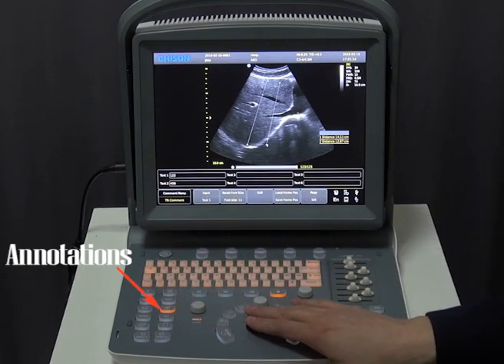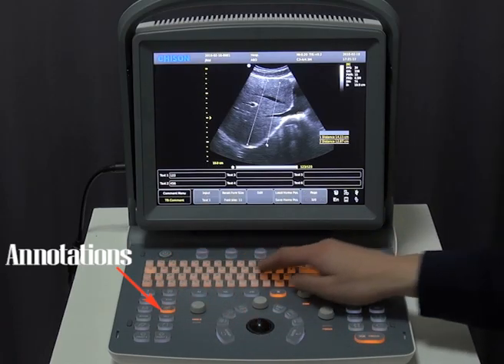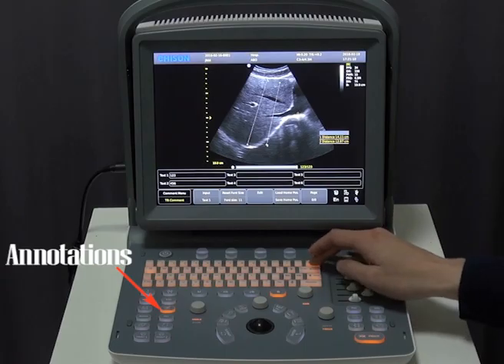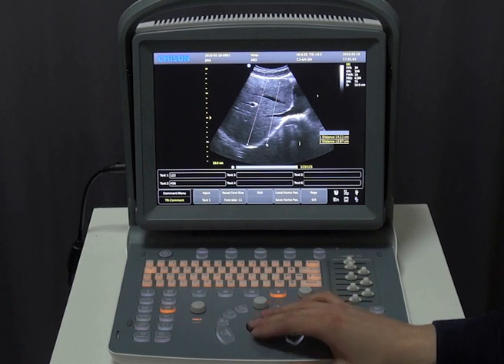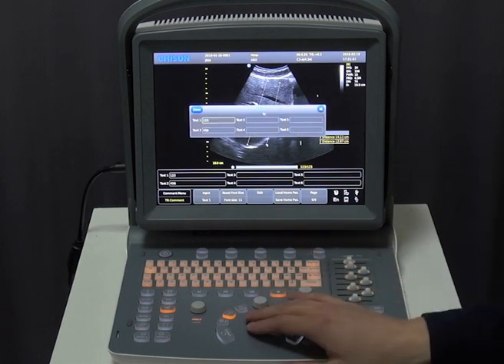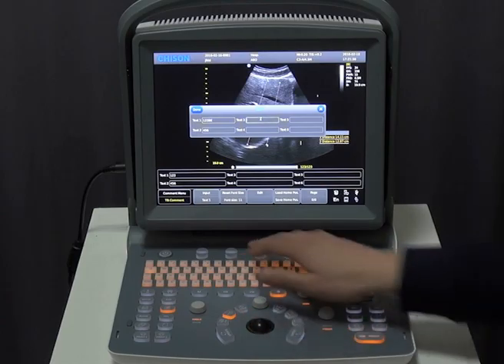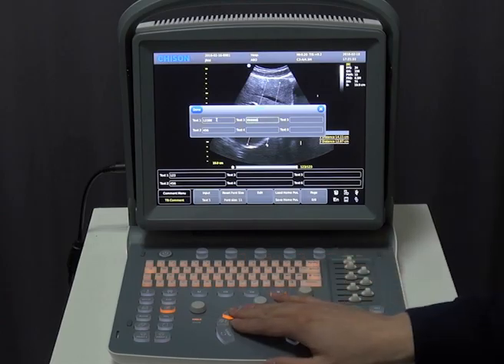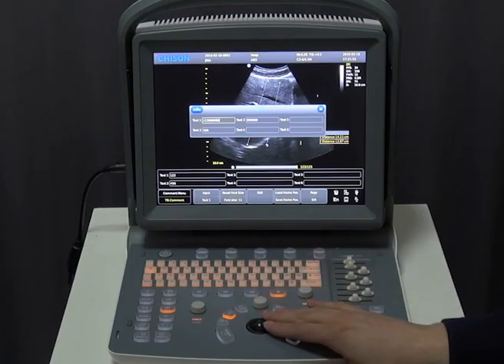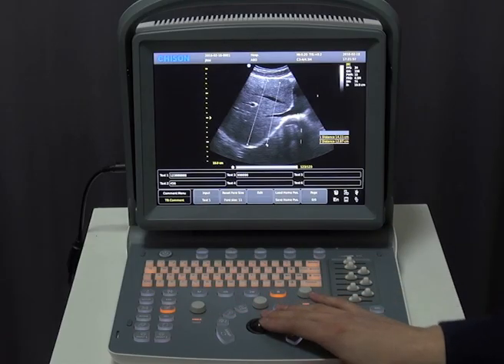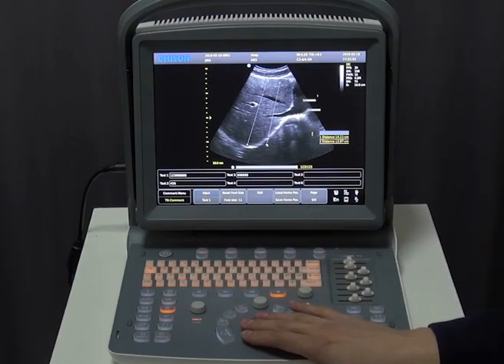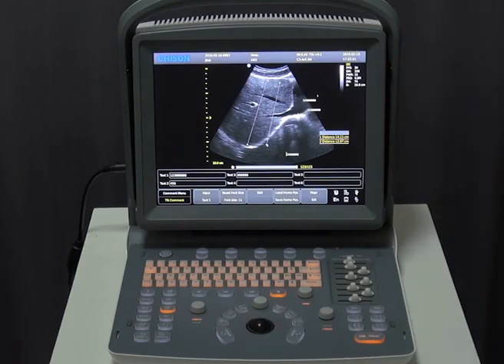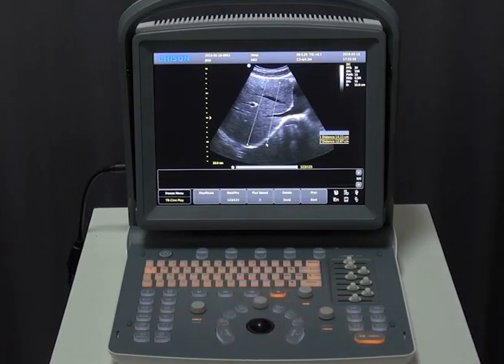If necessary, we can also add annotations. Hit the annotation button to enter annotation mode — we can start typing directly. We can also add our own quick comments by clicking Edit, which allows us to add up to 6 custom comments. Select Text 1, push down for input and it will automatically appear on screen. To clear those comments, press the delete key once and it clears all the comments.